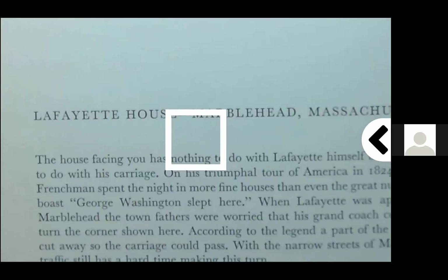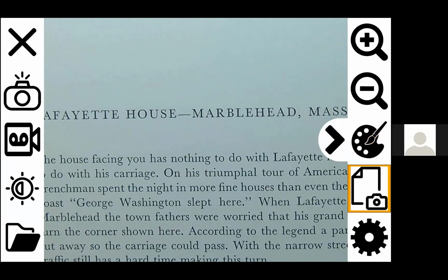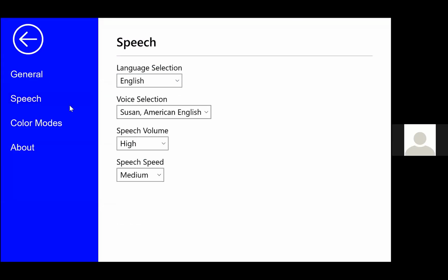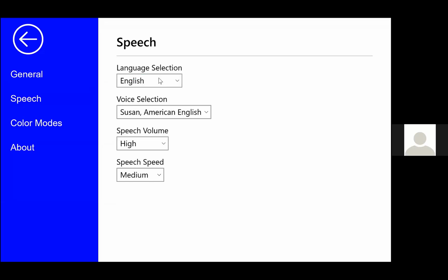I do want to show you one other thing here. Someone had asked, I saw in the chat just pop up. I didn't see all the questions, so I apologize, but I did see one here. It asked about the speech. So you can come in here and change the speech. You can change it from English, German, French, Dutch, or Spanish. So those are your options if you have text in that language. So if you have German text, you can choose that to read that, scan that.